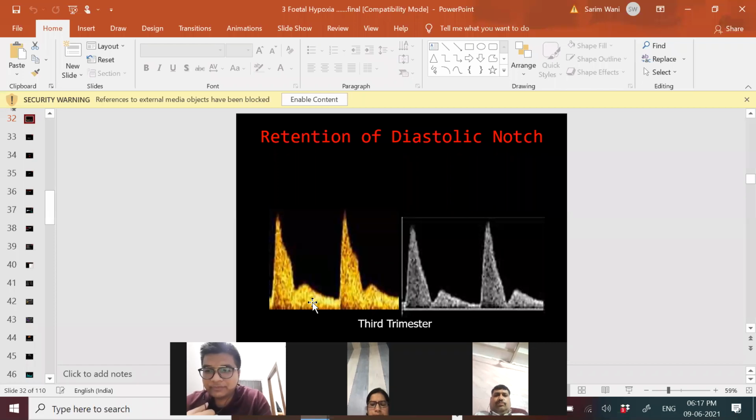Now, with decrease in diastolic flow, is the S by D ratio increasing or decreasing? Increasing. Dr. Sandhya, back to you. Yes, sir. What you are taught, this is not a problem with you gynecologists only. You are not the first person. What gynecologists are thinking, I don't know why. Please pardon me for that.